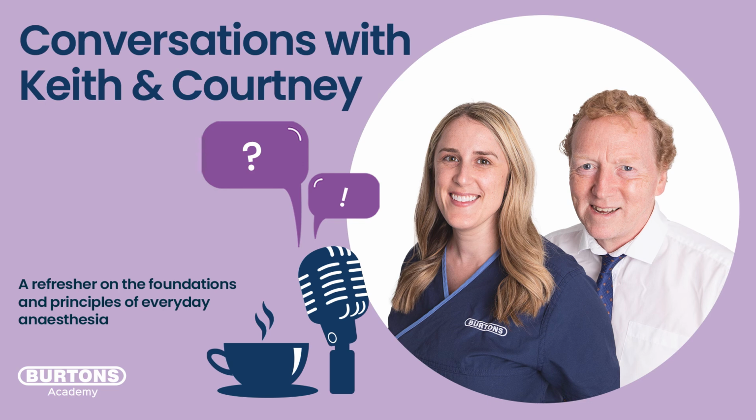Let's take a circle system where animals spontaneously breathe. There's no ventilator. We're just spontaneously breathing. Animal breathes out. The capnogram level goes up. The trace rises. We get a plateau phase, end expiration. And then we've got a significant pause. The animal's going to just wait before it starts inspiration. Well, that CO2 level will just be maintained. It would look like a continuation of the plateau, but there's no air movement at that point.